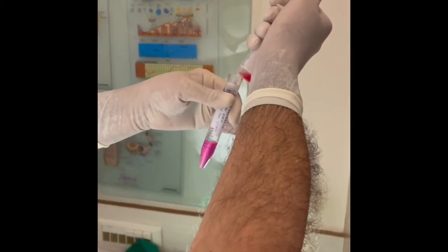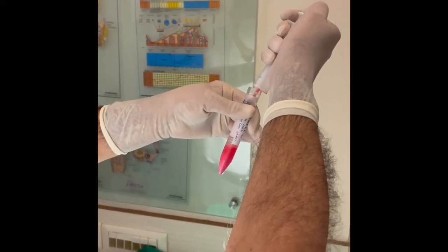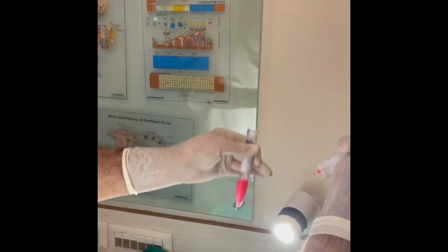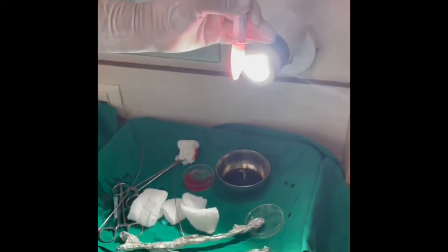Mount it into the screw cap tube with culture medium. You can see the floating villi in it.